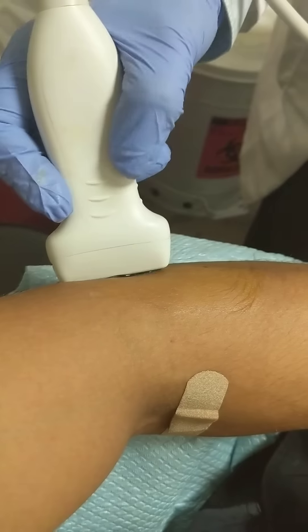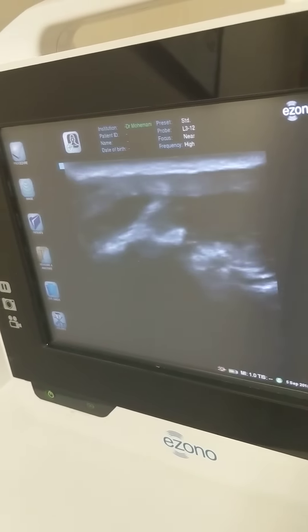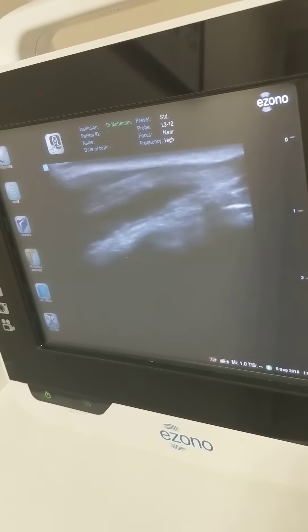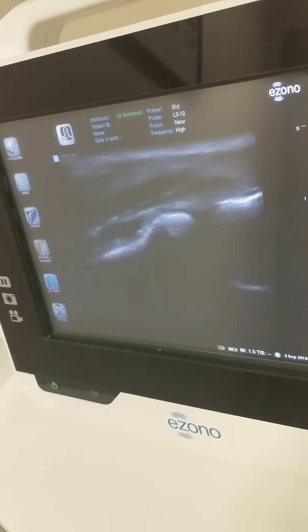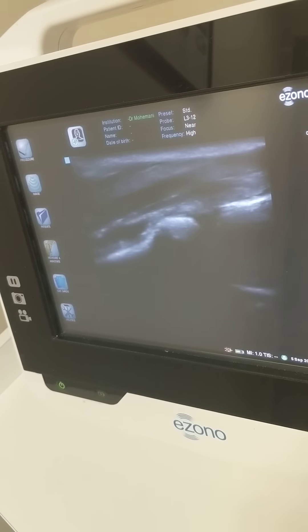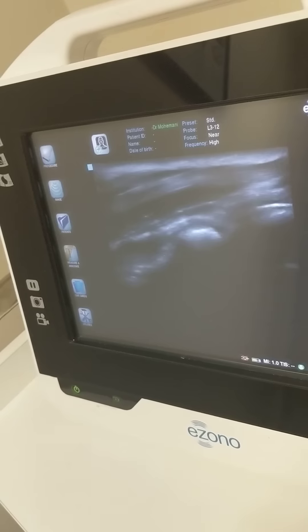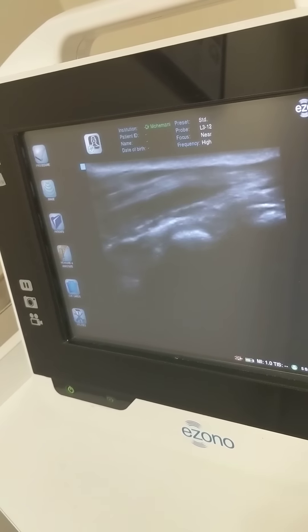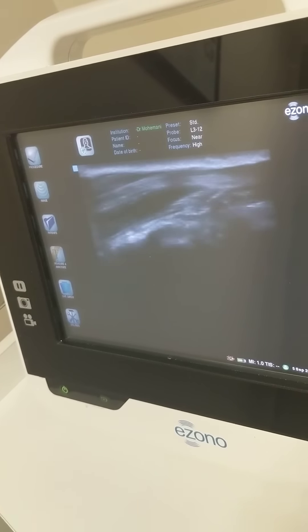Here we go, guys. Getting the ultrasound set up. Here's the ultrasound — you can look over there. That was my elbow. There's the tendon, the radial head. The tendon is superficial — we can visualize it. Do you see the damage? Yeah, you can see some signal change right there. The dark signal probably represents some damage.